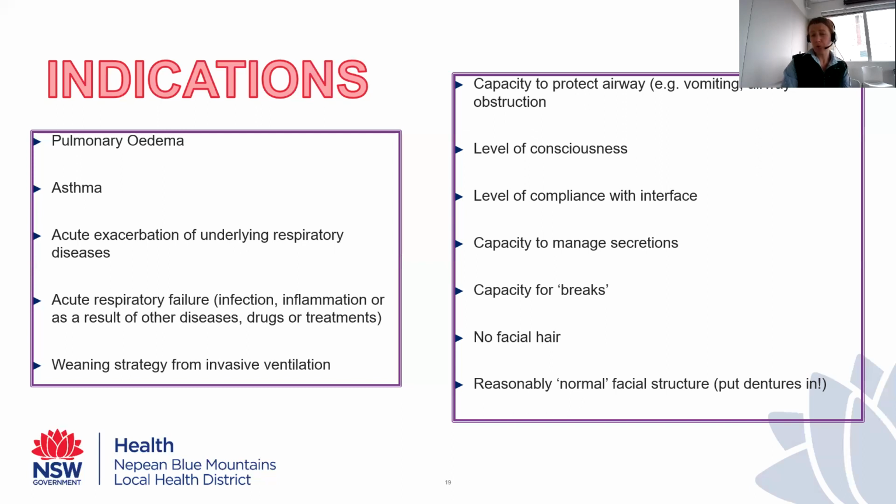So the patients that we put non-invasive on need to be able to, maybe not happily, but need to engage with us in a way where we can talk them through the therapy. We can apply a hard plastic mask to their face, and we can talk them through particularly the initiation of that therapy. The patient needs to have capacity to manage their own secretions.